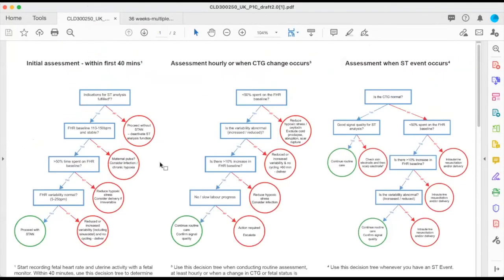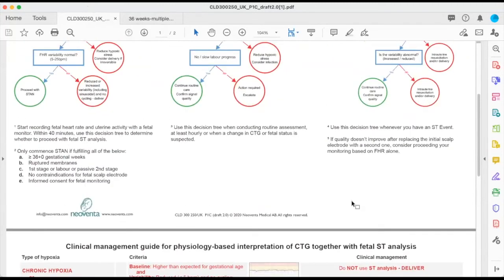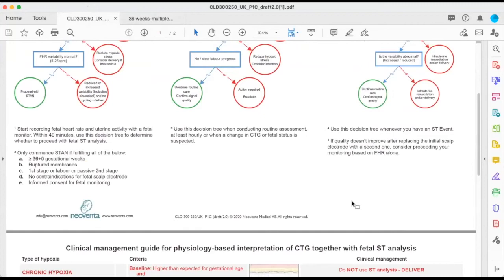So a bit of prerequisites before we are ever starting. And I'm sure we've all seen this now. Gabby has shown this on all the teaching sessions. Let's go through this bit by bit. Let's see who we can use it for first. Remember, this is taking a baby for itself, comparing it to itself. It takes some time to establish a baseline, and it now needs to monitor the baby. So prerequisites before we're starting, okay, this technology has not been tested earlier than 36 weeks. Hence, we can't apply this to anyone who's less than 36 weeks, okay?